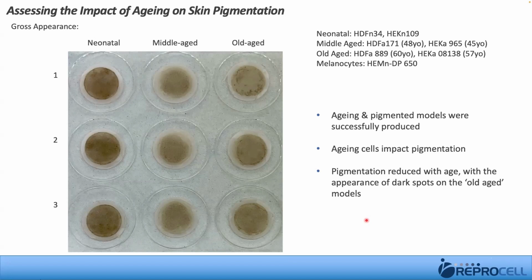This is interesting because this could simulate age spots, which appear, of course, on individuals as they age. You'll notice them on the back of people's hands, for example, exposed particularly to light. This is something which we're currently developing further. So that's very unique to our work.